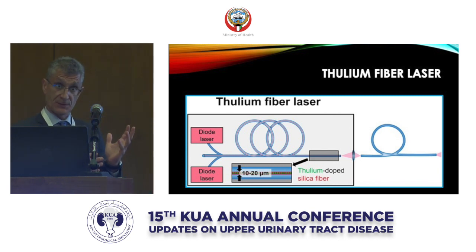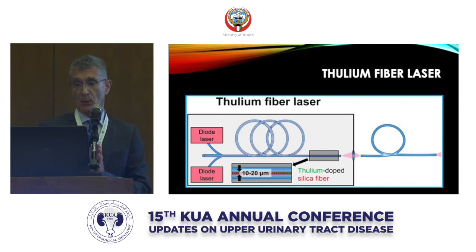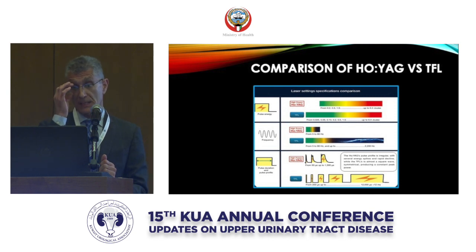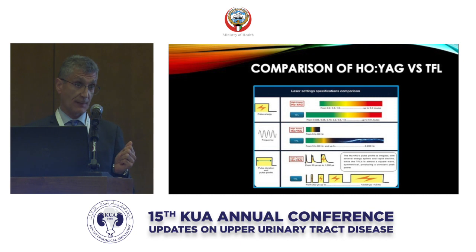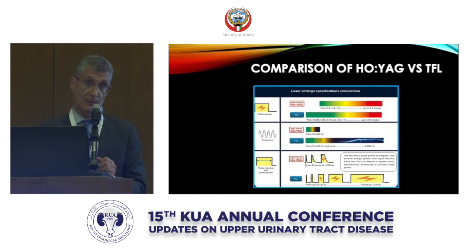I mentioned water absorption is a little bit different with these two lasers as well, and why that is important. Well, the thulium fiber laser's higher water absorption coefficient means that if we use that as a surrogate for destruction of cells, it produces a much quicker ablation ability. So for soft tissue applications, you can actually cut the tissue much quicker. And also for lithotripsy applications, that Moses effect that many of us have heard about with the high-power holmium YAG laser, well, actually this Moses effect, of course, is relevant for all lasers. It actually may be more effective with the thulium because it really allows that second ablative destructive energy burst to be much more efficient. It will hit the stone because we have the full energy. We haven't absorbed it all in the water. So the idea is that this Moses effect may be a more efficient process than with the holmium YAG technologies.